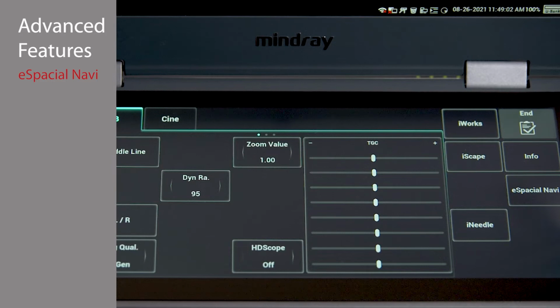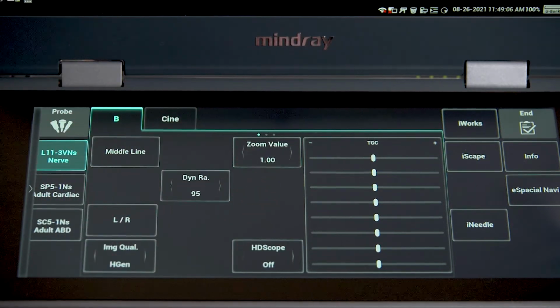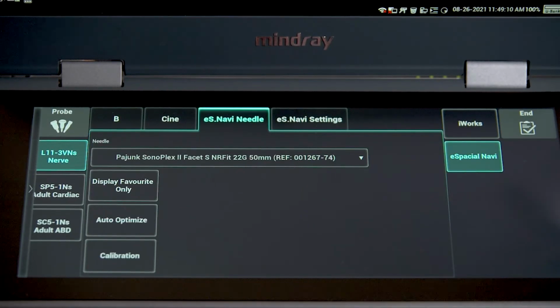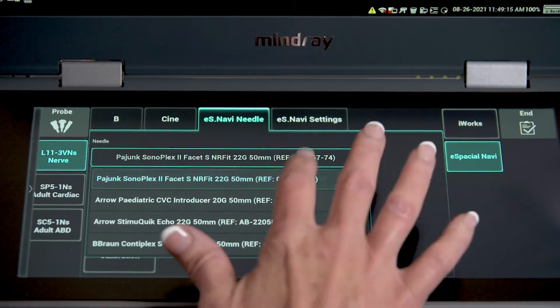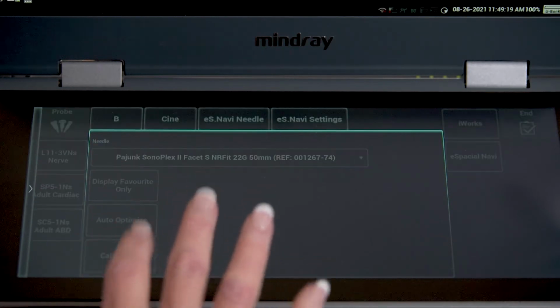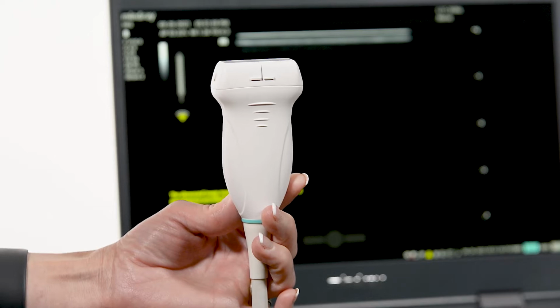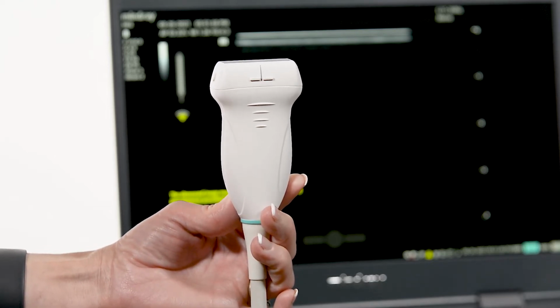Initiate the L11-3 VNS transducer in preferred exam mode. Press the eSpatial Navi tab on the touch panel. Verify the needle being used is approved by selecting it from the list in the eSpatial Navi Needle tab. Press the calibration button with the transducer approximately 12 inches from the system and at the same level as the top of the ME8 monitor.